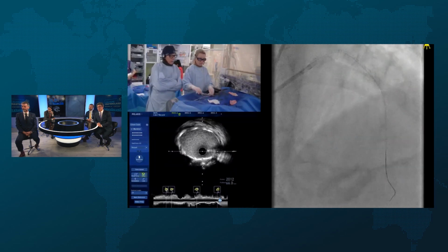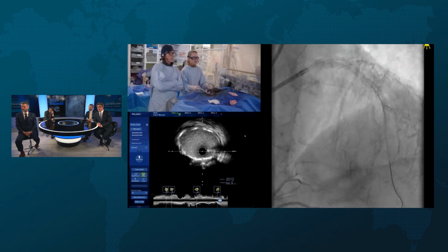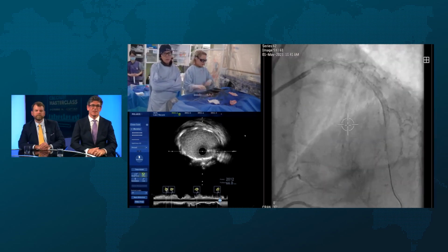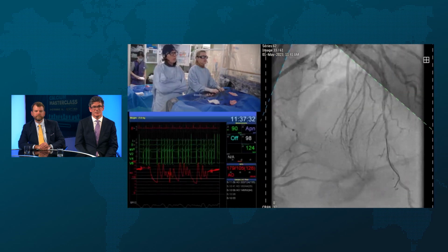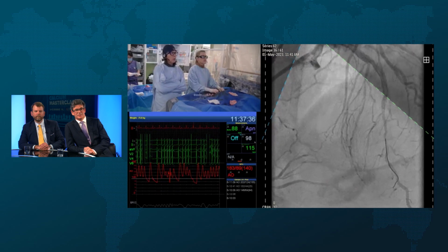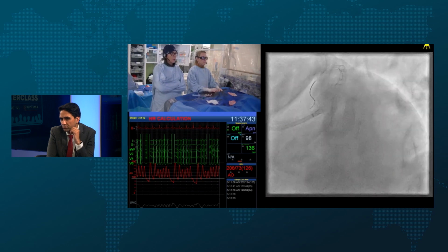Ready for a picture? That looks great. And just do a spider. We talked a little bit about the diag proximally, and we elected not to sacrifice our guide extension use to have a wire in that either, and that's held on really nicely. The ostium looked healthy. Just give us another view just so we can see the ostial segment.